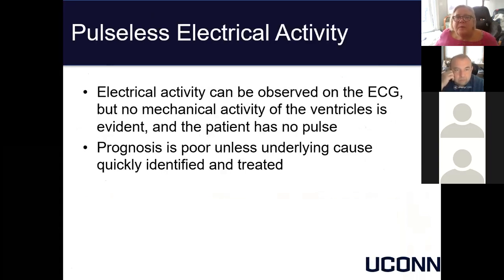Yep. Now, pulseless electrical activity. I've got to tell you guys, this is one of the scariest things around. You've got a patient on telemetry. You check their rhythm as they're walking by and you see conduction there. You go in to check your patient and they have no pulse, not breathing.